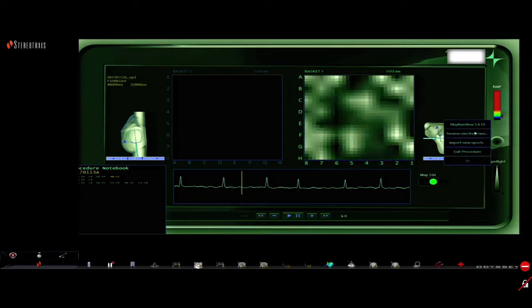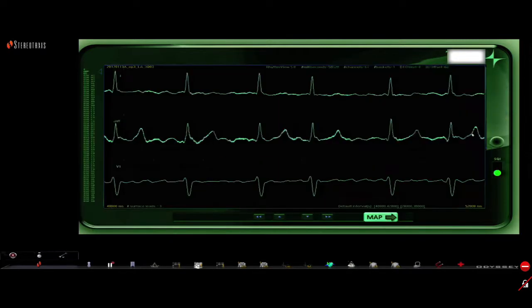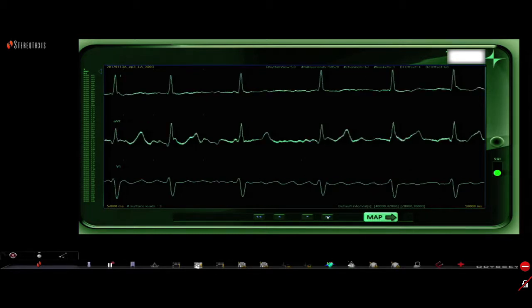So David, just to make sure we understand this, you showed us a post-ablation map which did not show the rotational activity anymore, and now you're showing us the site where we were looking. Then there was another suggestion at E3, and we're looking to make sure that's reproducible, at least over several segments. It was stronger on the first segment than on the second. We're now going to look at another one. Okay, I'm just moving a 1-minute segment. We're going to look at another 4-second one. The idea is that we want reproducibility.